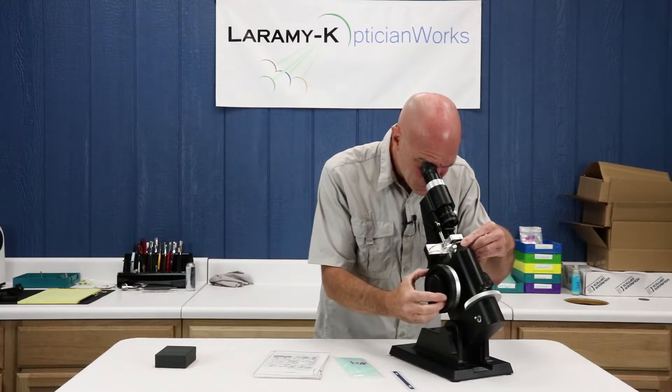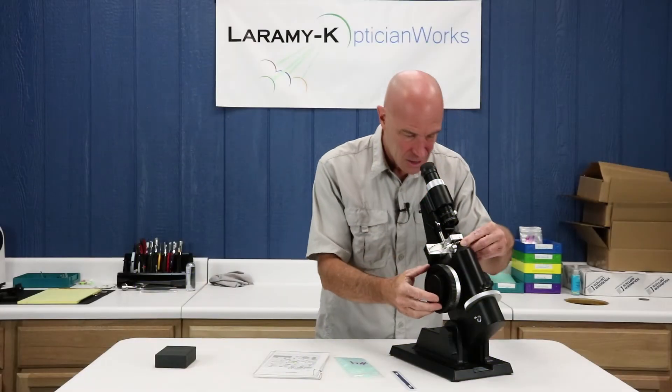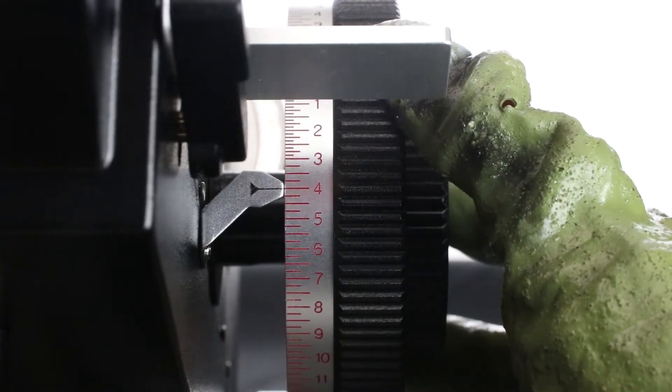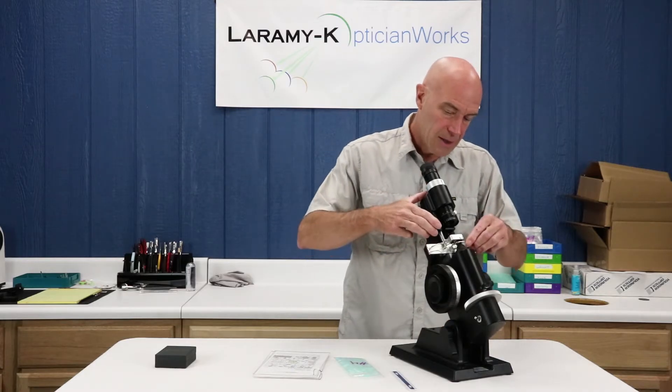Move your chrome knurled sleeve around and rotate your power drum away from you until you have good crisp cylinder lines. Work everything so it's all lined up. You are at 2.75, you moved 1.25, so you should be at the power drum at minus 4.00. That lens is looking good — we can put our three dots on there.